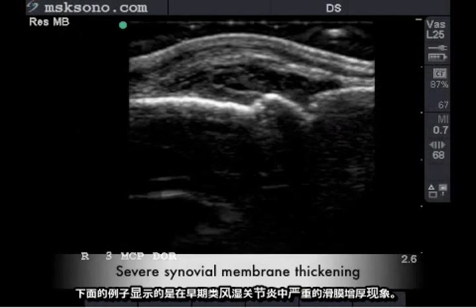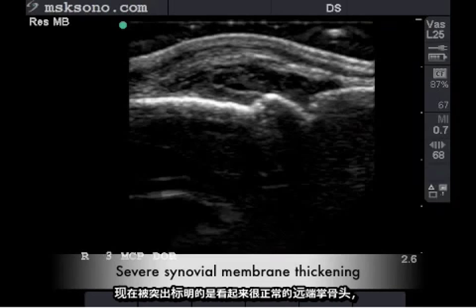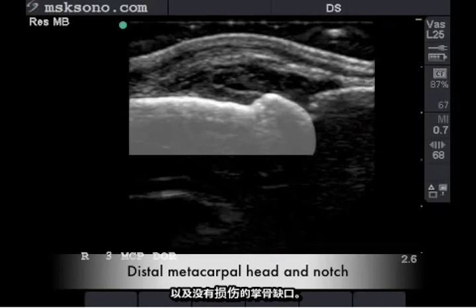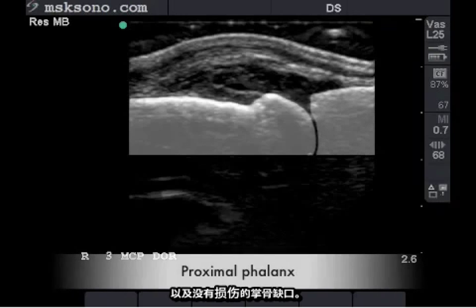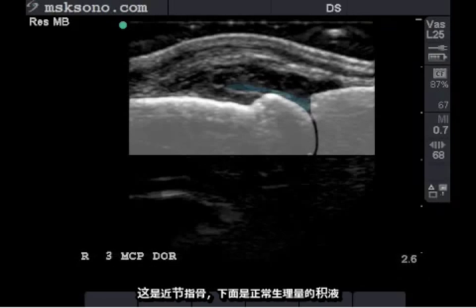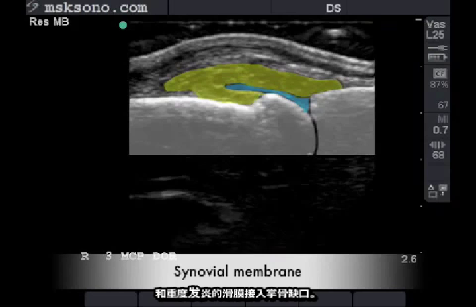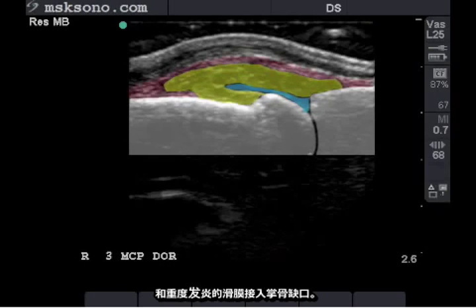The following study demonstrates severe synovial thickening in early rheumatoid arthritis. Here we have highlighted the normal appearing distal metacarpal head and metacarpal notch with no erosion. Here is the proximal phalanx, followed by the normal amount of physiologic fluid, and our severely inflamed synovial membrane as it inserts to the metacarpal notch.